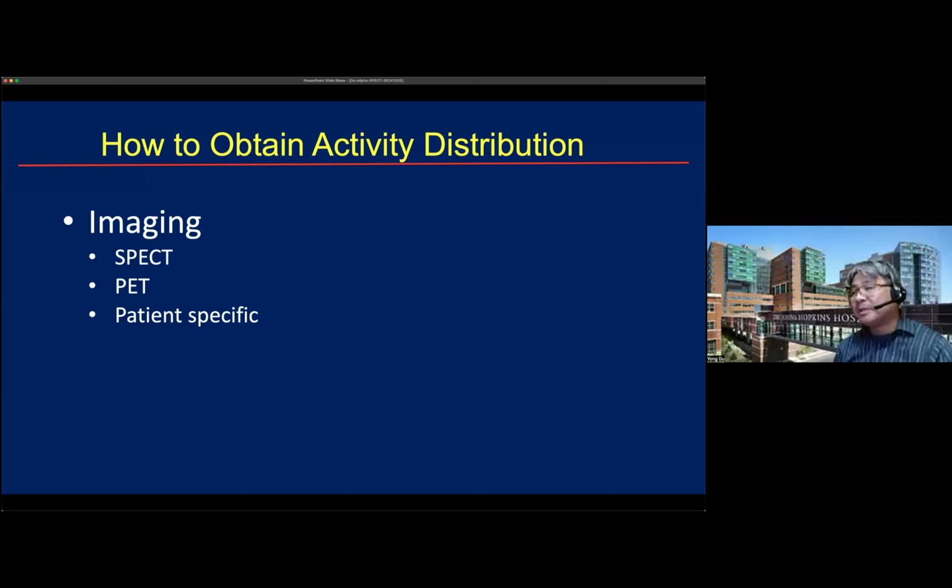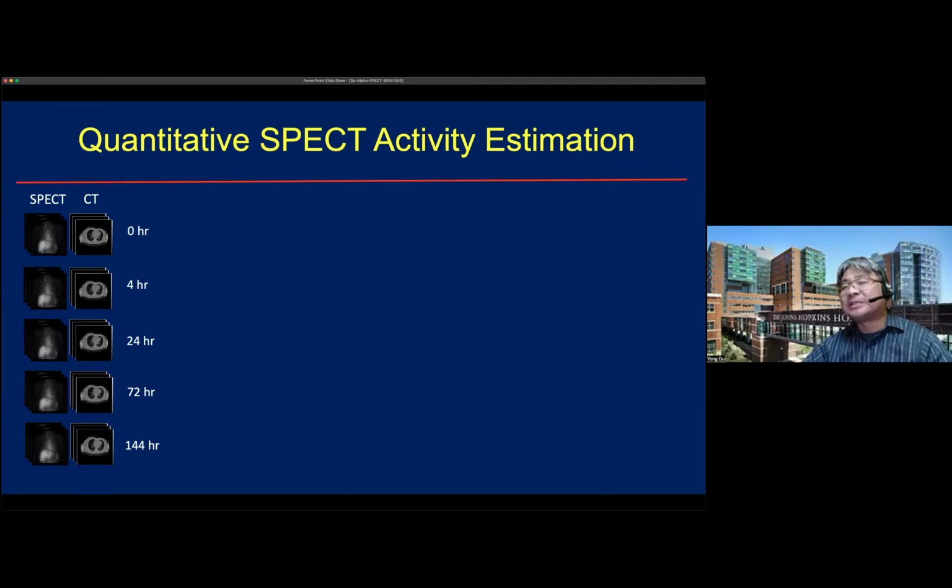This figure shows how we can use SPECT to do the activity estimations. Basically, we can do SPECT imaging of the patients at 0 hours post-injection, and at 4 hours, 24 hours, 3 days, and 6 days post-injection. From that, we can do the SPECT acquisition.